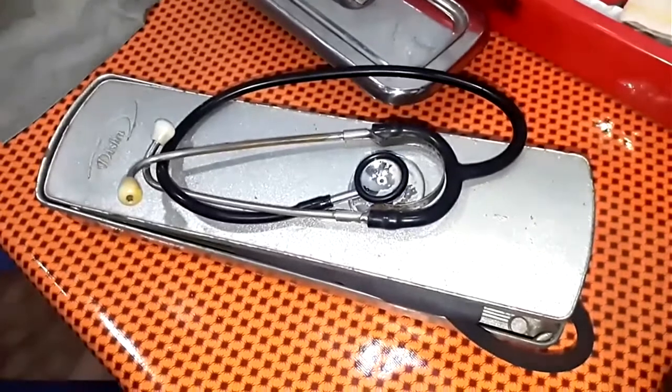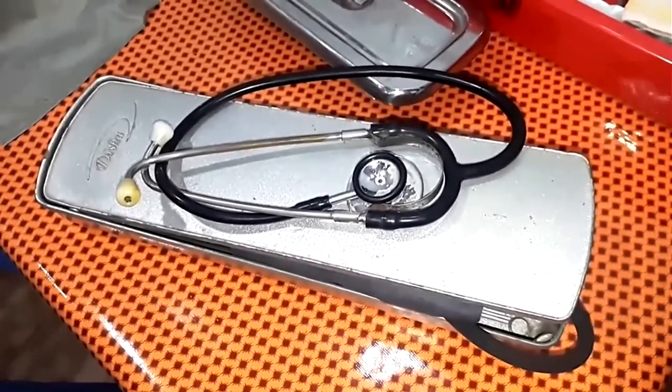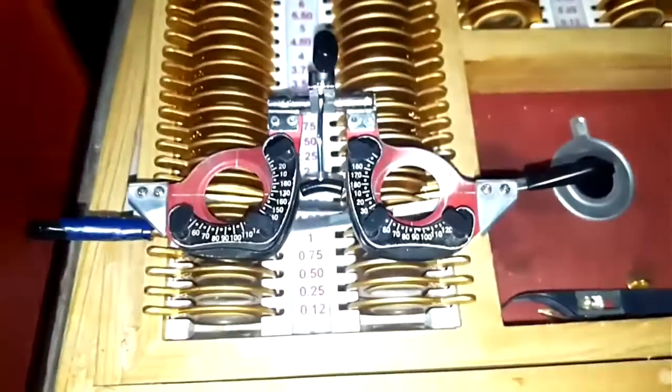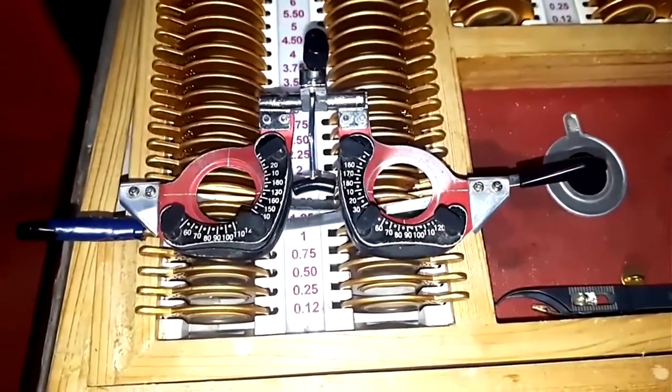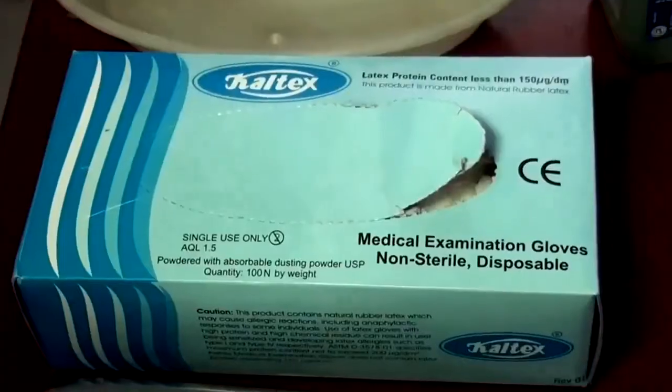Other things we neglect are the stethoscope, the BP apparatus, and the trial sets. We need to clean them. We hardly clean these. At least once a day, you should clean them.